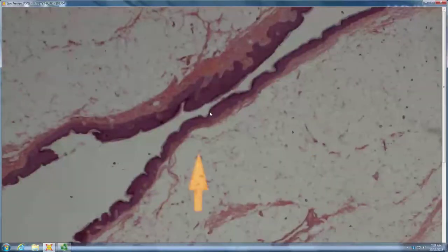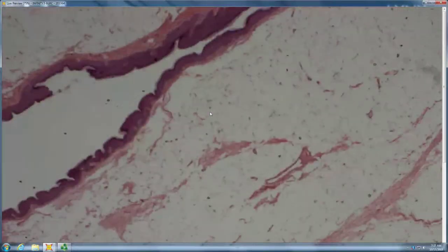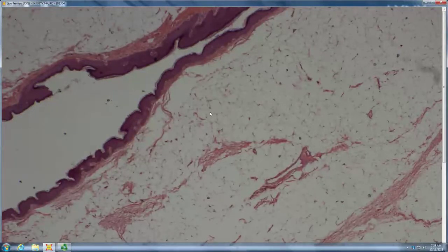The fat is pretty high, right? In fact, you don't have a whole lot of the dermis, so it looks like the dermis is hypoplastic, one might even say. And so Goltz syndrome, what's the other name for Goltz syndrome? Focal dermal hypoplasia is the other name. It's not really a hypoplasia, it's actually a neogenesis of fat that squashes all the collagen out of the way, because it starts as perivascular fat and then spreads.